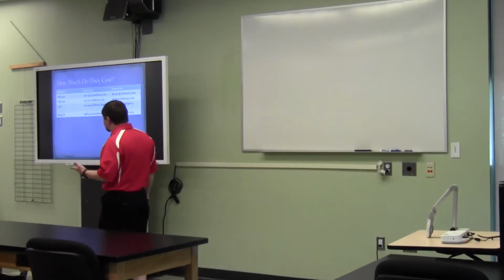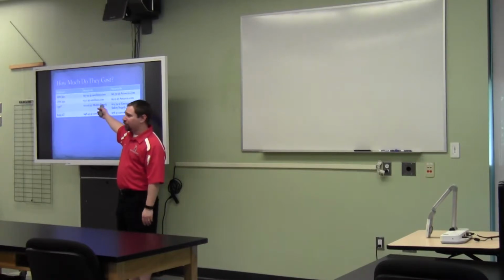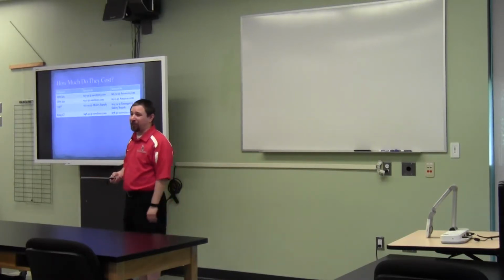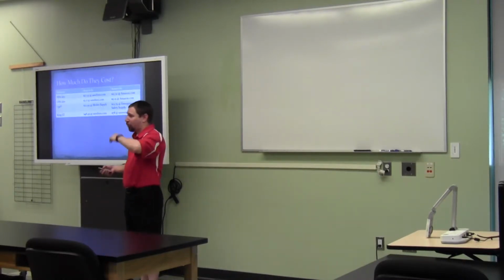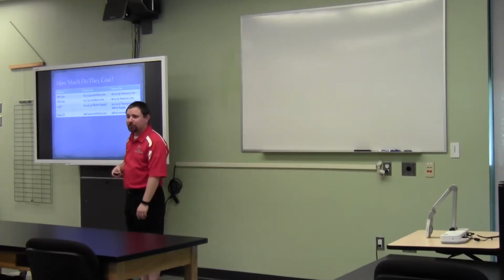Looking at the iGel, the good news is it's actually pretty cost effective. I was surprised on that one. I was expecting it to be a bit more, but I found it for between $20 and $25, depending on the supplier. Then you've got the King LT, and like I said, this is the one without the suction port for the stomach. $48 to $78 are the two places I found them.